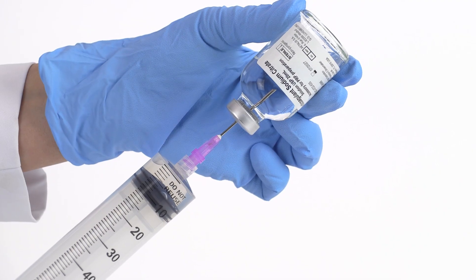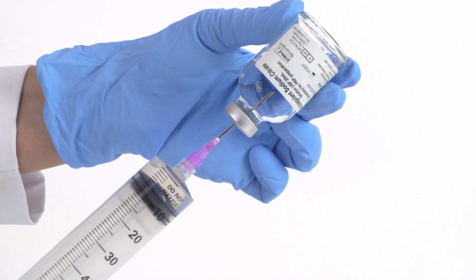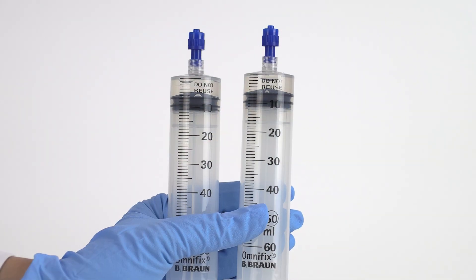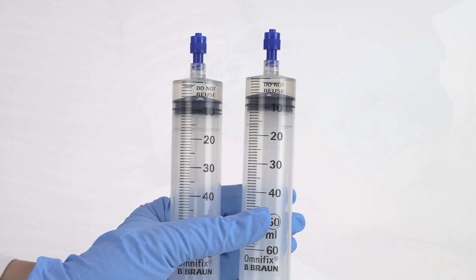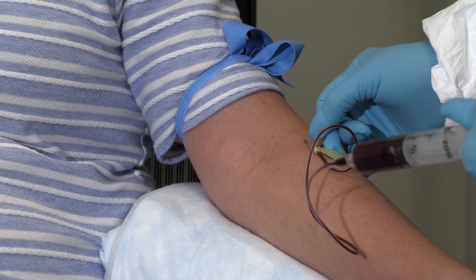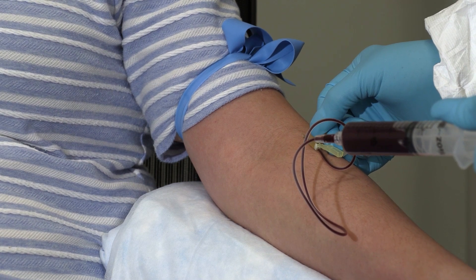Fill two 60-milliliter sterile syringes, each with 6 milliliters of citrate anticoagulant. Then draw 54 milliliters of blood in each syringe, filling each syringe to 60 milliliters.